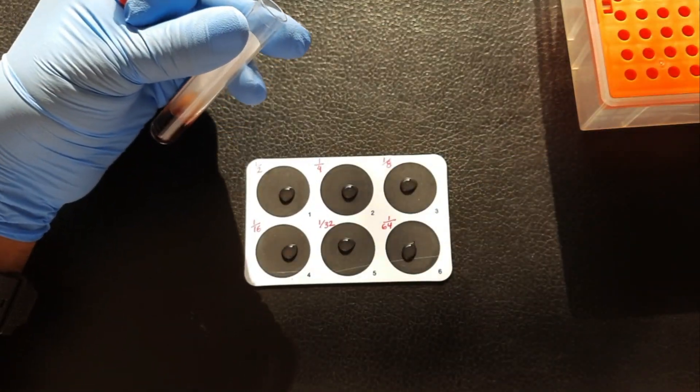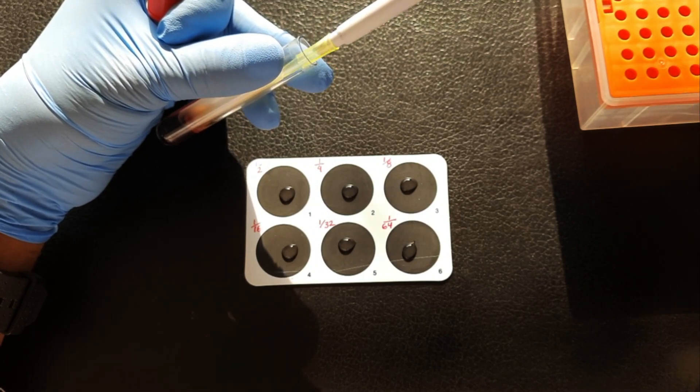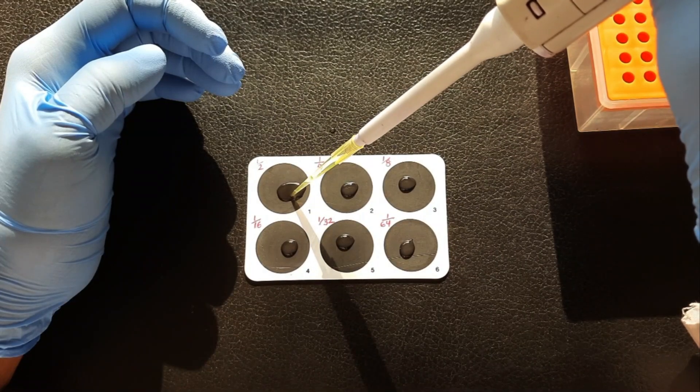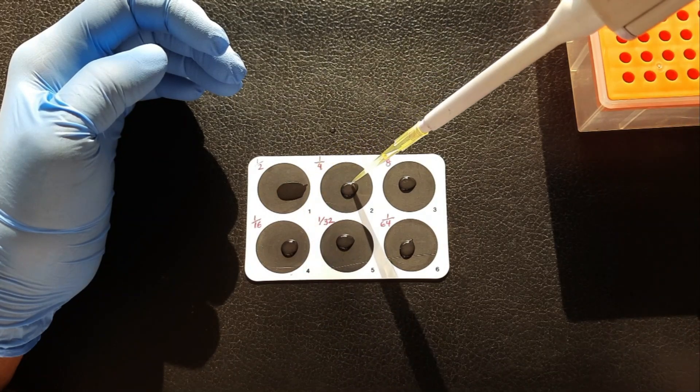Then, place 50 microliter of serum sample on circle 1 and mix it properly by pressing the plunger of micro pipette 3 to 4 times, and take 50 microliter of this mixture from circle 1, place it on circle 2, and mix again.